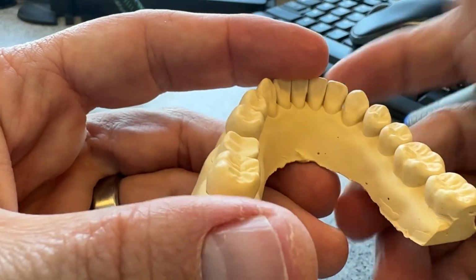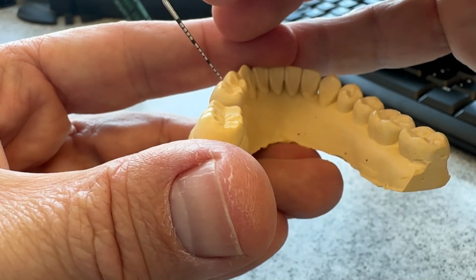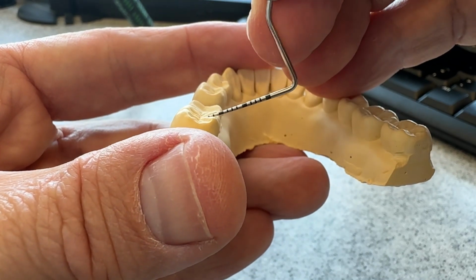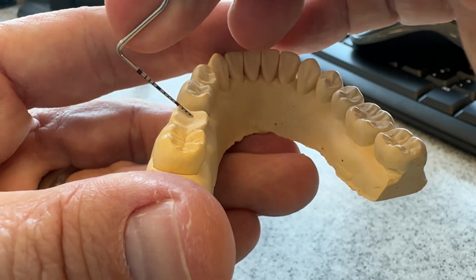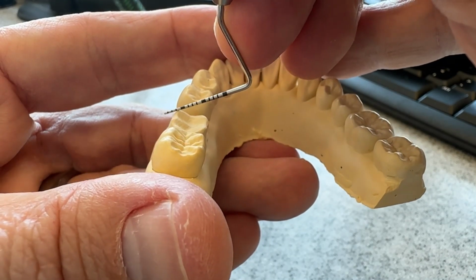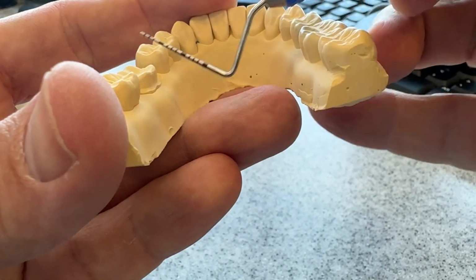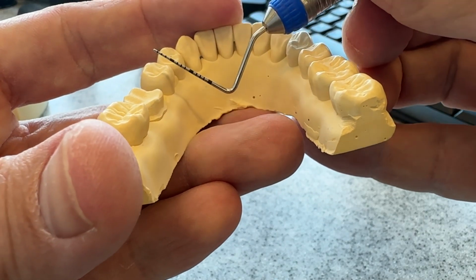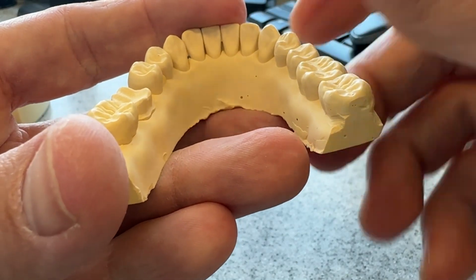And then what the mirroring looks like from a buccal lingual perspective is we're staying in the planes that the teeth naturally have, okay? This functional cusp is angling down, and then the non-functional cusp angling back up. So we want to keep that same buccal lingual angle. So we've got the functional cusp bevel, functional cusp, non-functional cusp, and then there is this slight non-functional cusp bevel here, which rounds that line angle off. You do not want sharp corners or a sharp line across here.